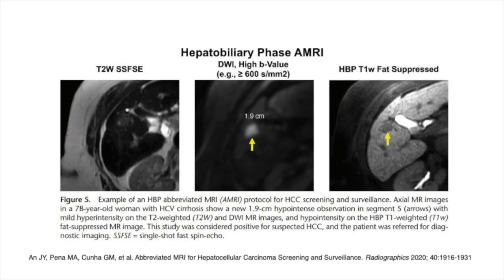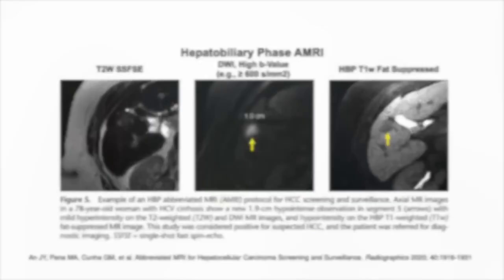There are two agents, gadoxetate disodium and gadobenate dimeglumine, but only gadoxetate disodium is proposed in abbreviated MRI protocols because of the much shorter delay to obtain the hepatobiliary phase, which is typically 20 minutes post-injection. To our knowledge, no study has compared head-to-head the performance of extracellular agents and hepatobiliary agents in abbreviated MRI protocols for HCC surveillance. We hereby present the point and counterpoint side for both types of agents.